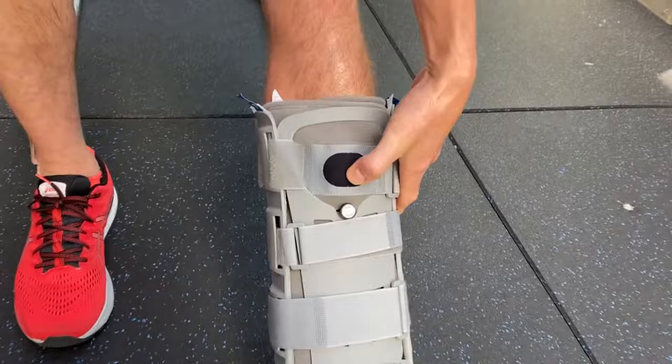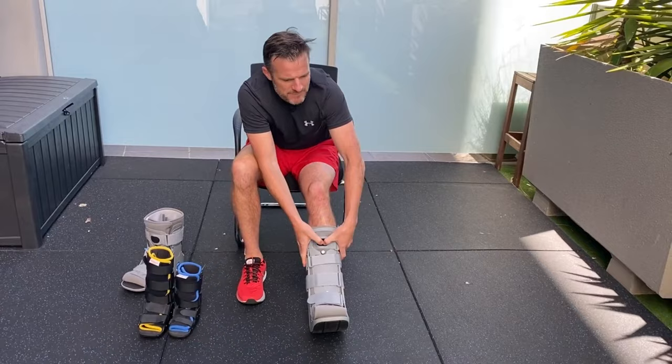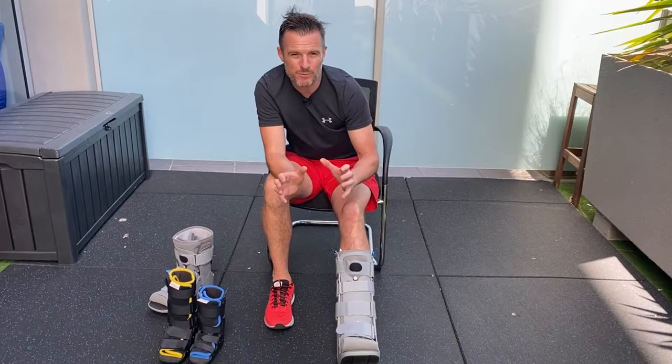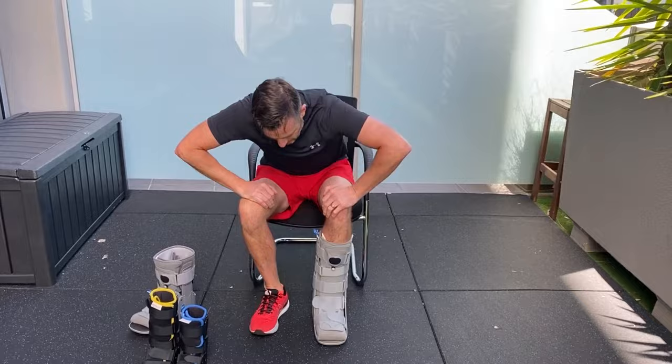Now pump it up. Keep pumping until you feel it tighten around your ankle — you'll know when you feel it. Pump to the point where you feel safe and snug, but not too much. After surgery, an acute rupture, or with a lot of swelling, too much pressure can hurt. You want enough to keep everything stable. If it feels too tight while walking, deflate a little and readjust.